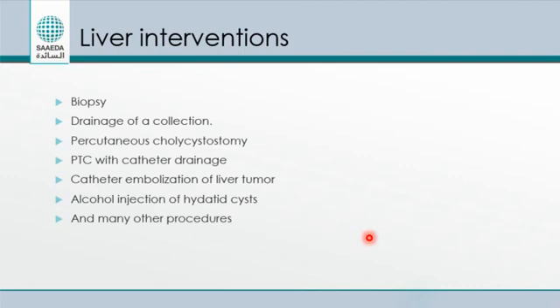He has multiple gallbladder stones, and in his current condition, anesthesia was risky. So his surgeon just requested a cholecystostomy tube. We put it there for like 10 days, 2 weeks, and we removed it. The acute episode was relieved, and he came like maybe 3-4 weeks ago. Remarkable improvement. Even the chronic inflammation is resolved. It's just a gallbladder with a few stones in it, and he's very healthy. This is a very underappreciated procedure.